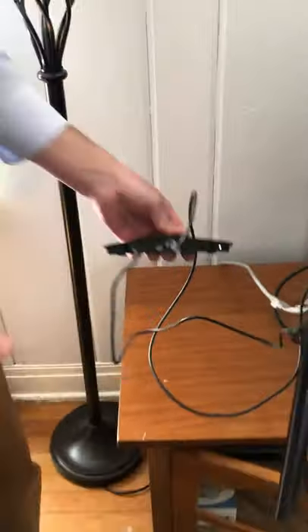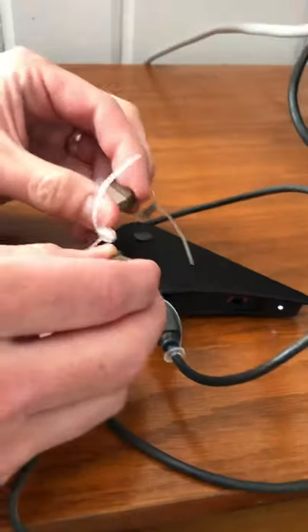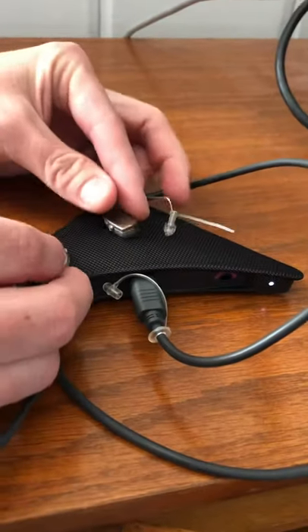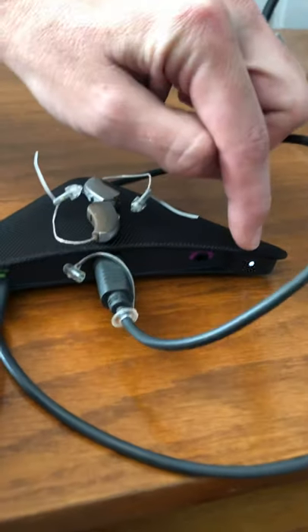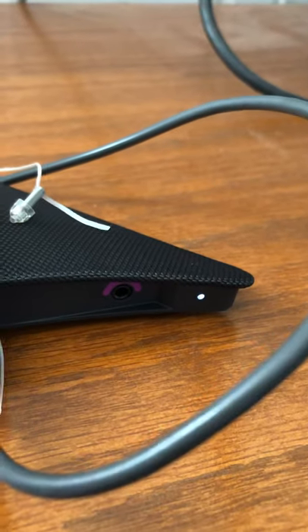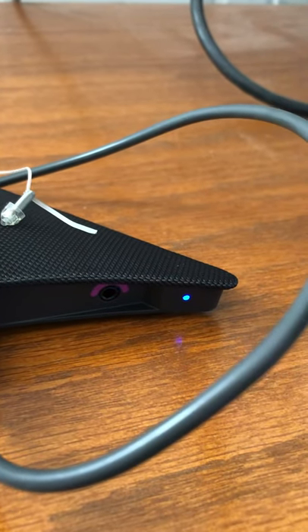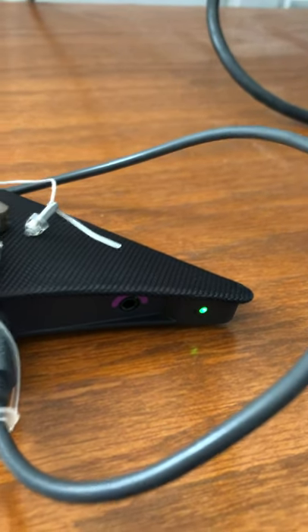The next step is to pair the hearing aids to the TV Play. The battery doors were open, so bring them nice and close and close the battery doors — one, two. We're going to take a look at that indicator light, and hopefully it will glow solid. There we go — it's blue, and now green. So now you are connected.